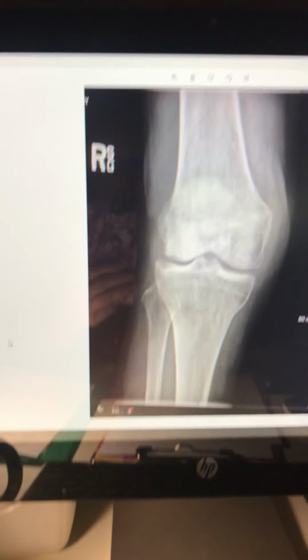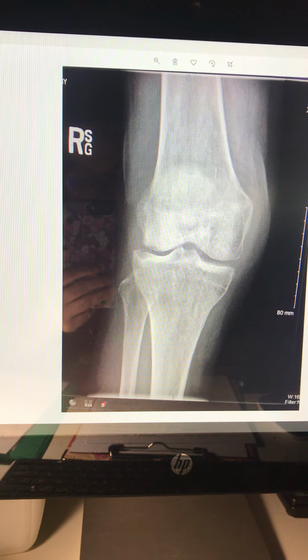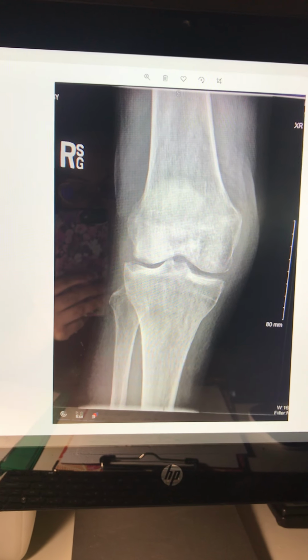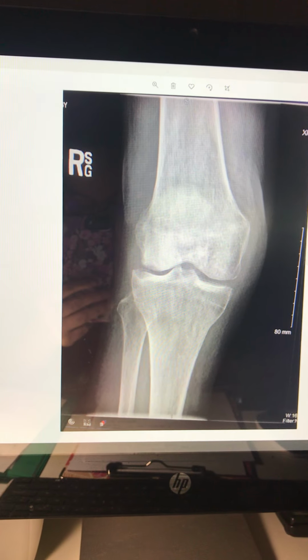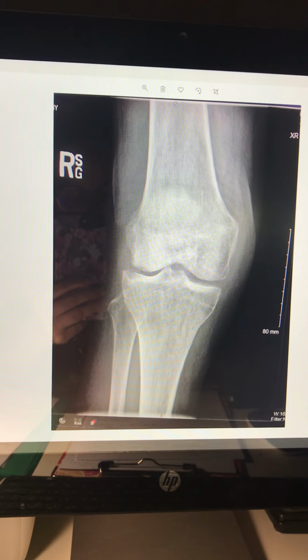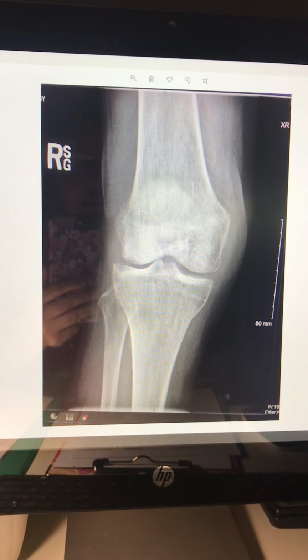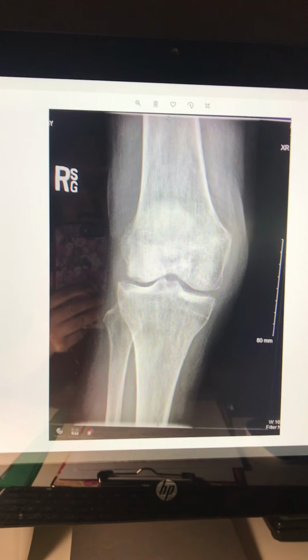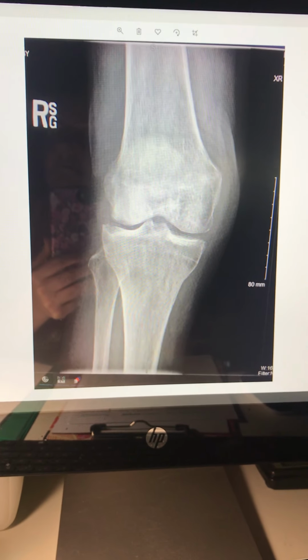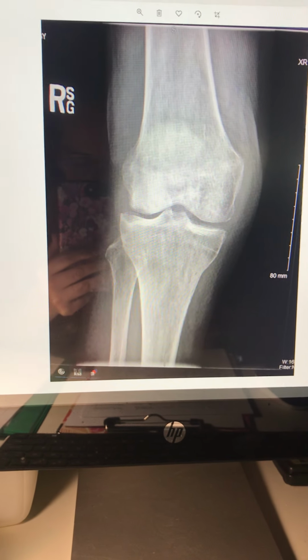So onto my images. I'm starting with the AP. A digital detector was used, a 16x16 with the grid in the table Bucky. The technique was 40 inches SID. I can't exactly remember the technique. I'm going to say a 68 at 5. I will double check, or you let me know if that's completely wrong.